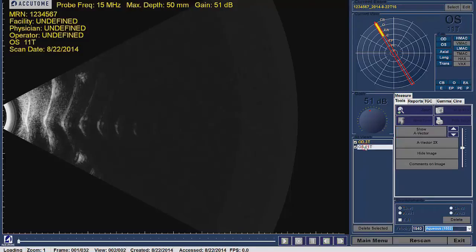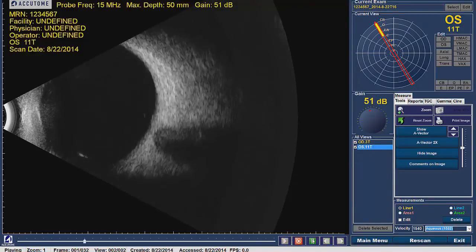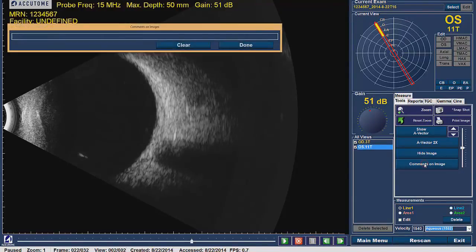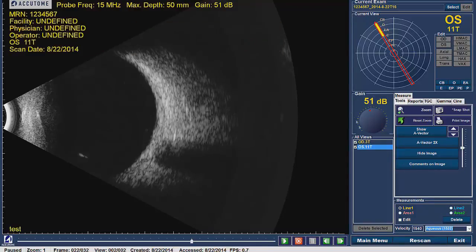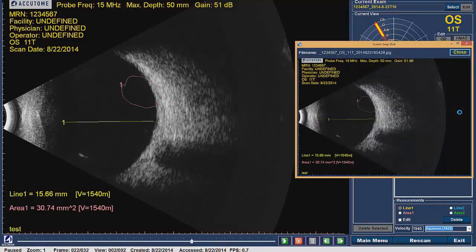With the Analyze screen now up, choose your scan or view and replay the movie. Stop the movie clip on the image that you would like to export. Once the movie clip is paused, add all comments, measurements, and labels that you would like to save, and then take the snapshot by clicking the camera icon located under the Tools tab.